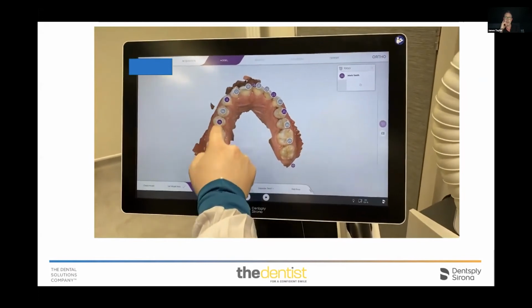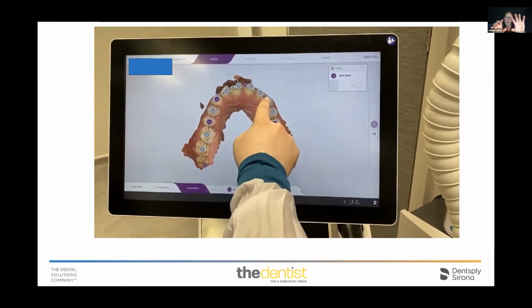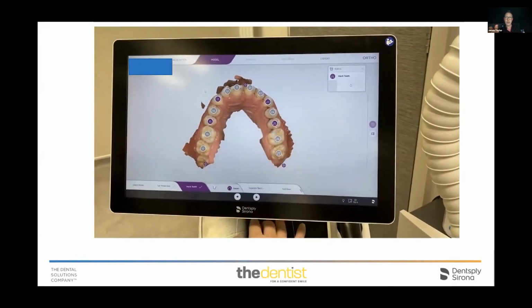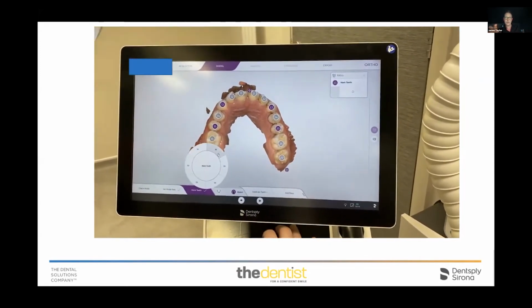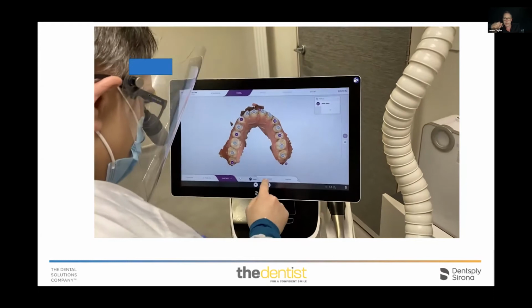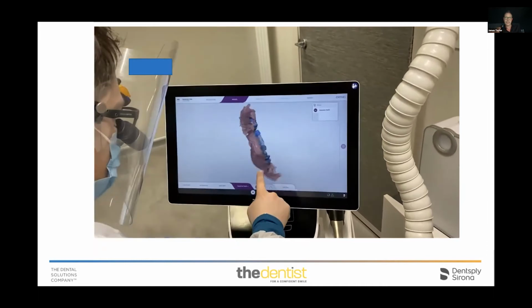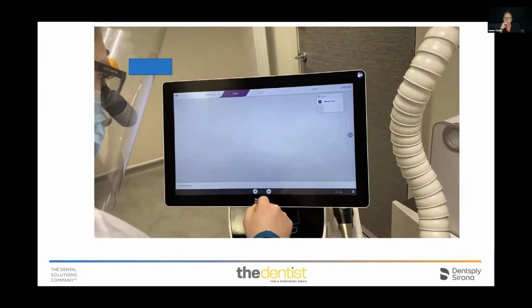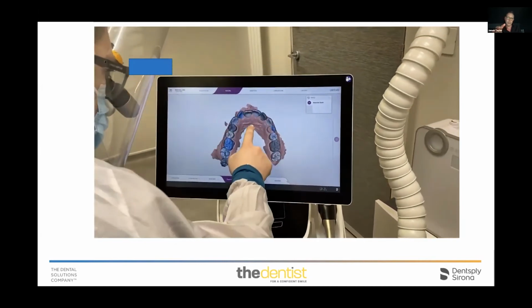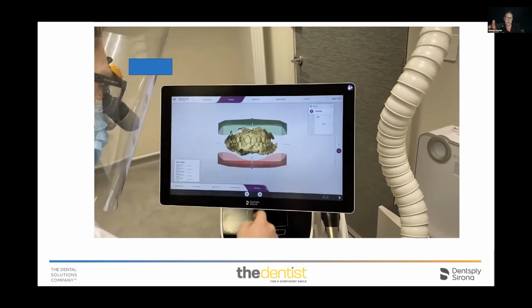And you can see how the upper 3, the upper 5, the main areas of the arch allow the arch to develop as you're creating and adding those tooth numbers. You'll add any appropriate teeth that aren't on there, such as 8s. And then the software will actually identify teeth and check that it separates them. It knows exactly which tooth is which. If it's not showing a full tooth in color, then you can modify that very easily. And then it will mount the scan onto models, onto a full model.